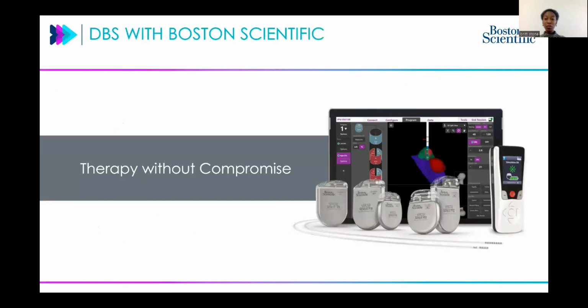So here's just a picture, if you will, of the whole system: the physician programmer, the patient programmer, and then the implanted units of your DBS system with Boston Scientific.